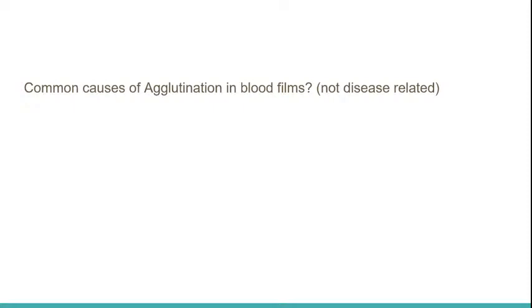There's a decreased count. We're going to check the samples, and oftentimes the analyzers that we're using are sophisticated enough to detect these flags, especially if it's done through impedance principle, which was discussed later, and also flow cytometry. Okay.